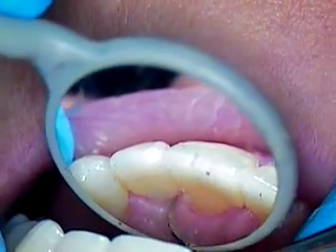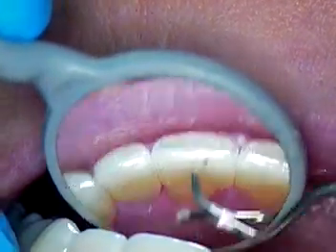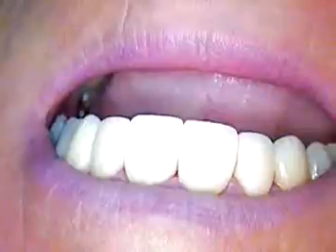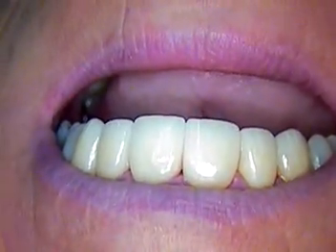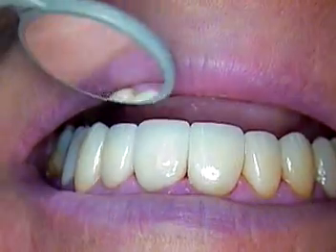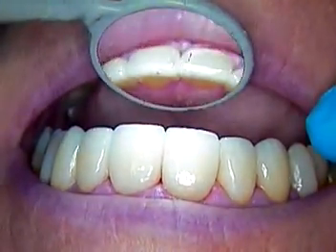We've still got some cement to clean here. I wanted to show you the finished case as it exists in the mouth. We got a very, very happy patient, I'm sure. Let's see your big smile for us. Absolutely. And that's what it's all about.